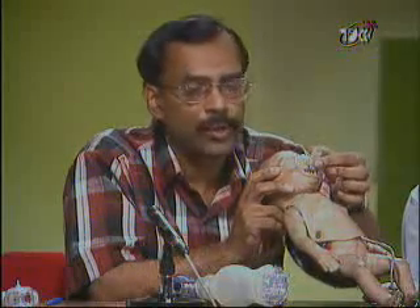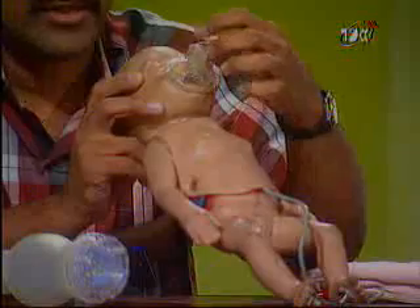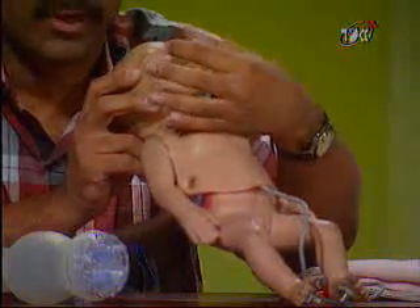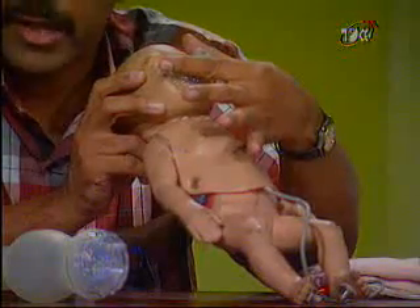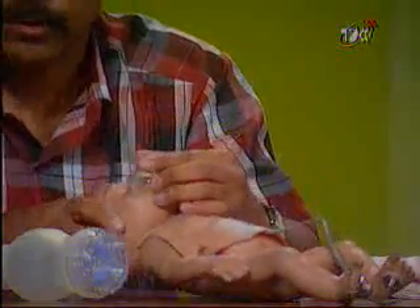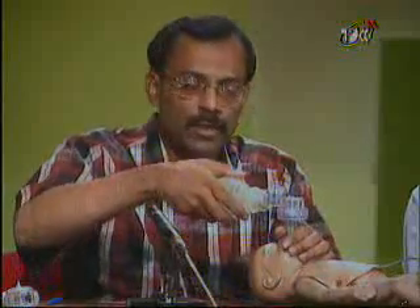To repeat the mask placement: it must cover the chin, the mouth, and the nostril. When you place this mask, you must see that it covers all these three areas, but must not cover the eyes of the baby, because when you apply pressure on the mask to seal, it can cause damage to the globes of the eye. Having got the right mask and the right position, we begin ventilation.